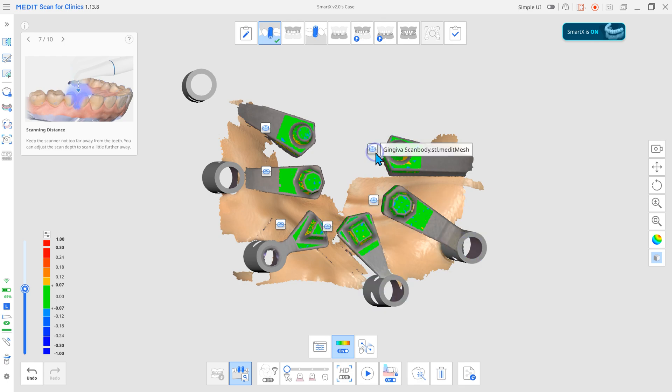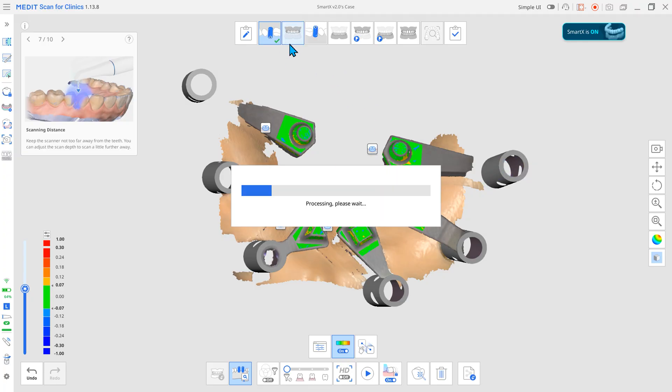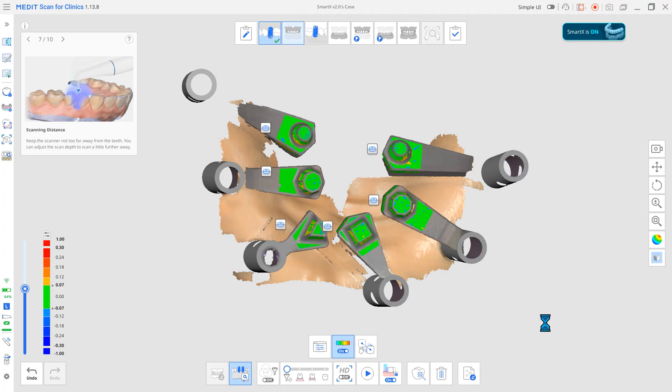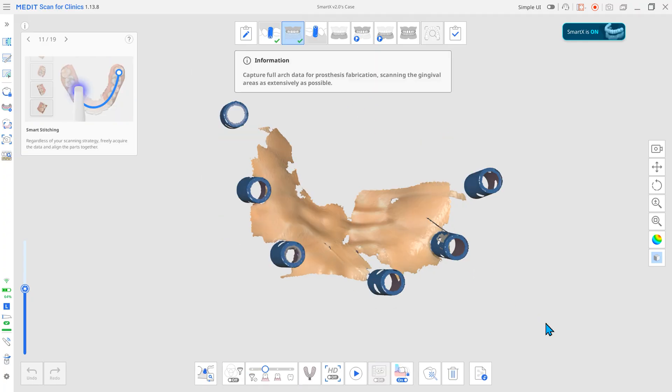The anchor cap is placed based on the scan body, securing an accurate implant position with minimal scanning and without additional programs.